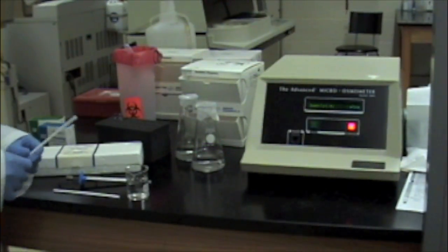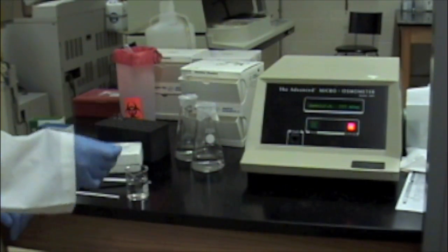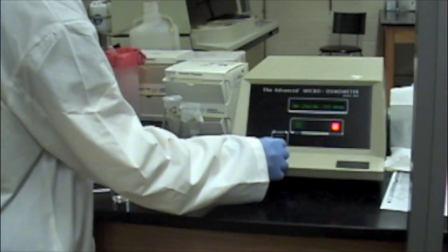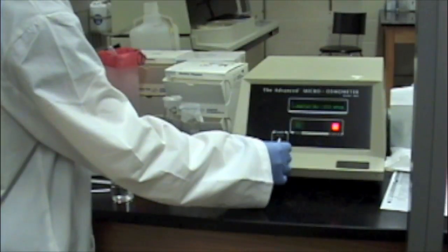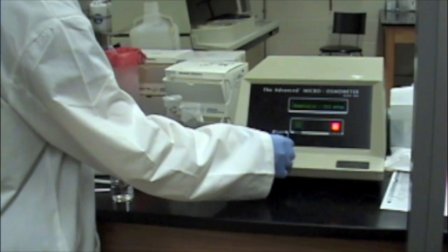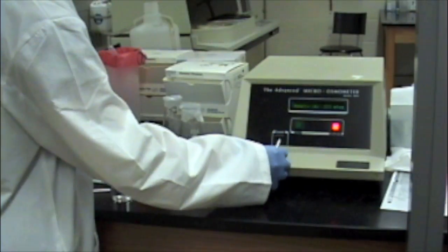When testing is complete, the port should now be cleaned. Wet a chamber cleaner with distilled water and insert it into the injection port. Rotate it three or four times before discarding it, and insert a clean dry sample cleaner, which should remain there until the next test.